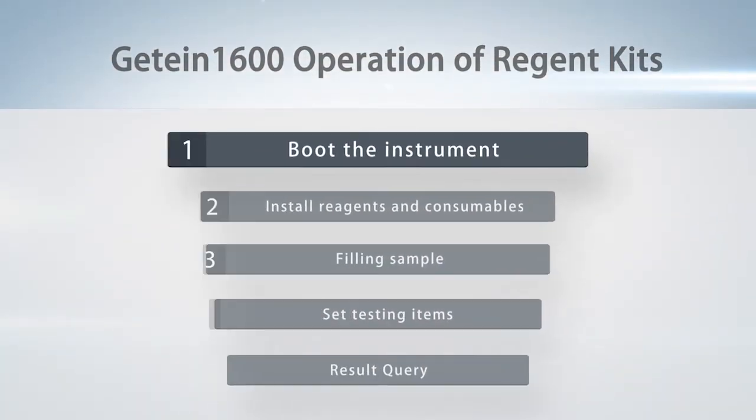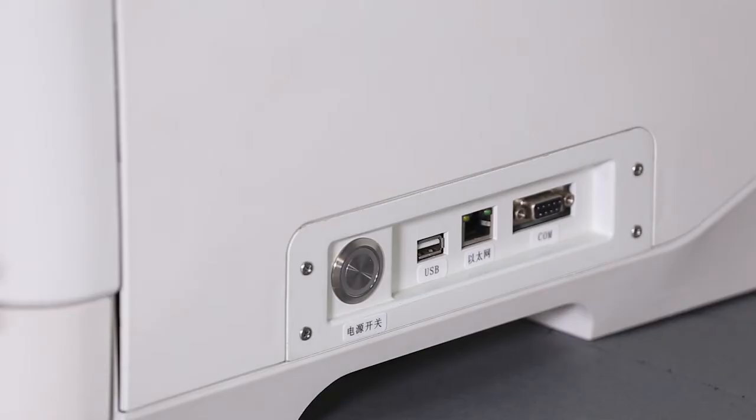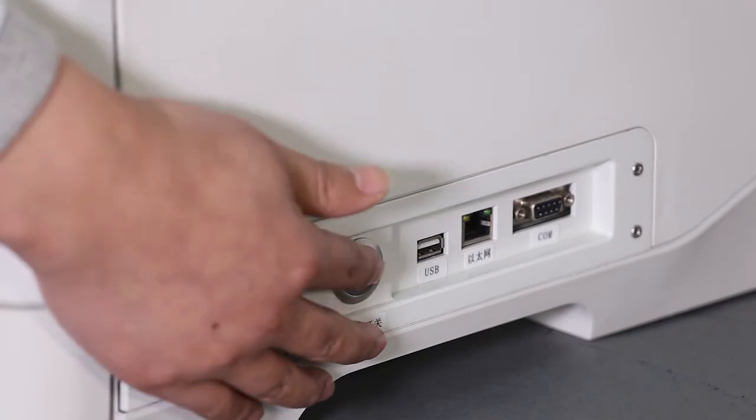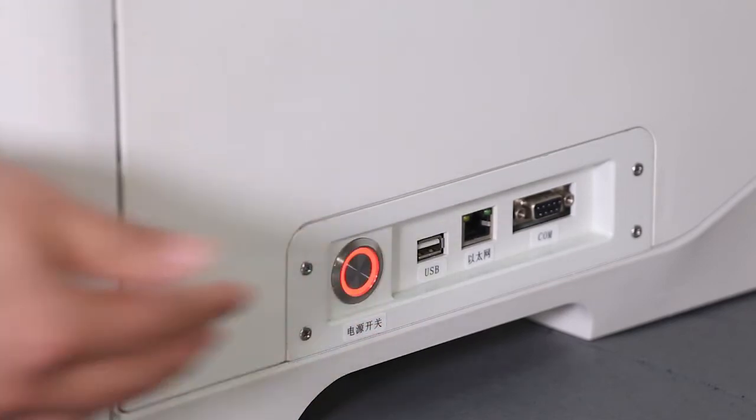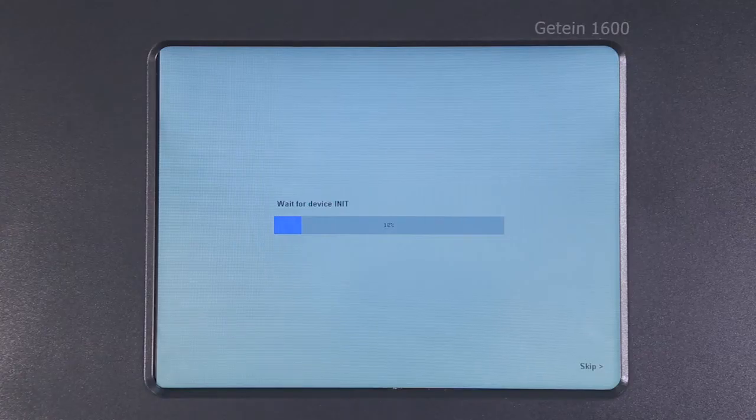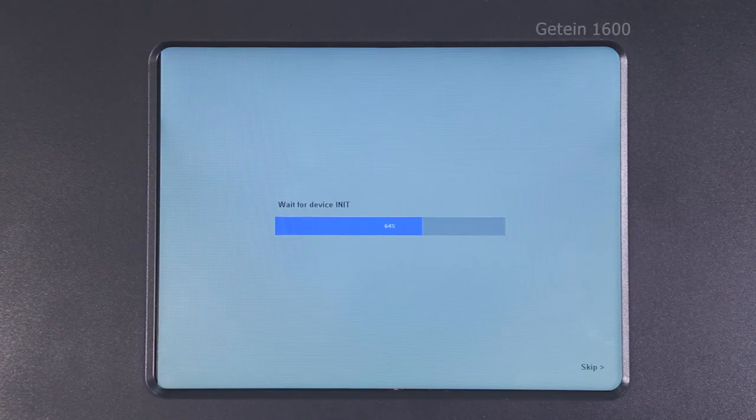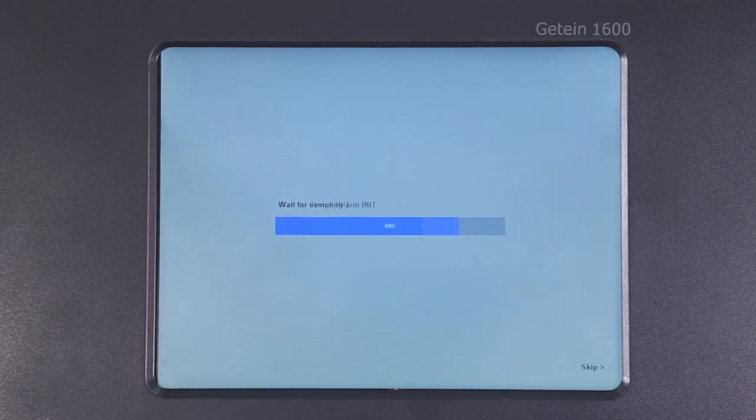Step 1: Boot the instrument. Turn on the power switch and Getein 1600 will automatically start initialization.